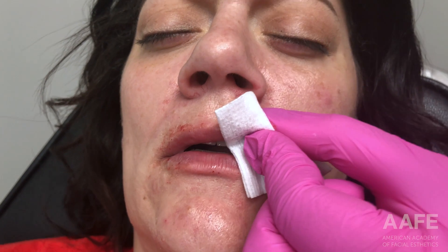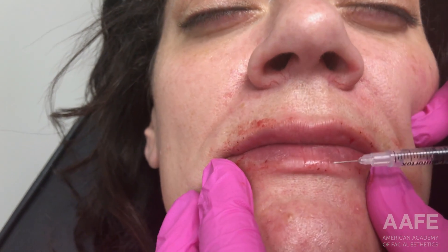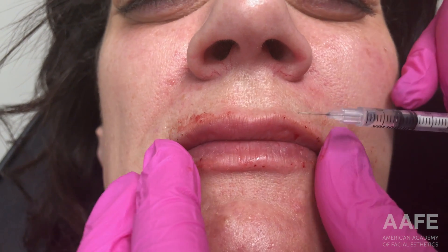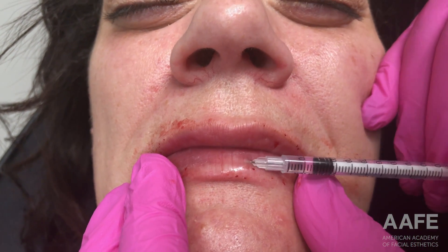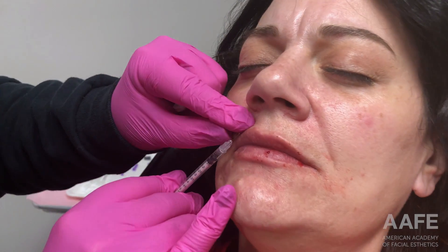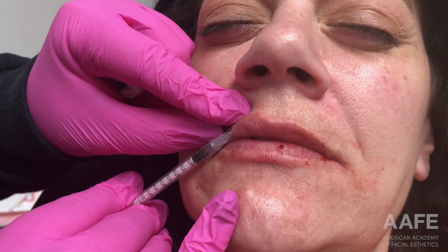Now that she has filler pretty much everywhere in her top and bottom lip, you'll see how I start to massage here in a little bit. Massage is just as important as your injection technique. Sometimes you may look at a lip and it's not quite perfect yet — there may be a little more filler on one side, little asymmetries — and sometimes just massaging the lip from one side to the next and making sure the product is integrated in the tissue can really help perfect the lip. You don't always have to keep adding more filler; sometimes they just need a good massage.